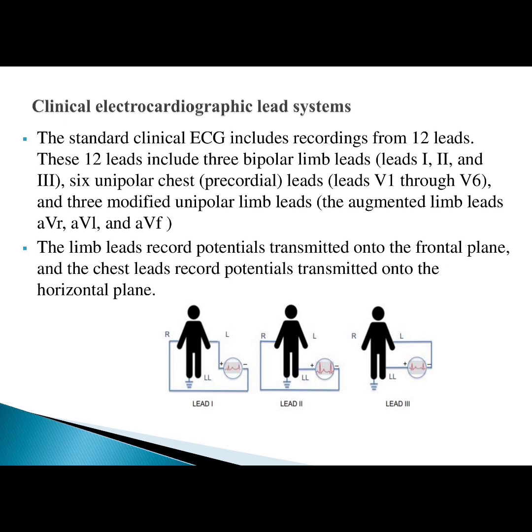Clinical electrocardiographic lead system: the standard clinical ECG includes recordings from 12 leads.